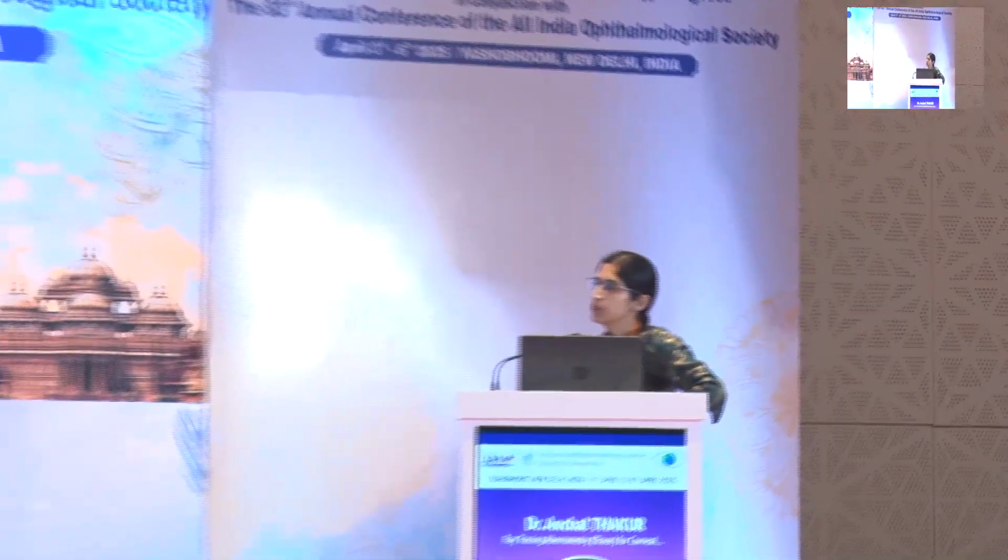This is a very good question. The subjective depth of focus is actually more than the objective depth of focus which the iTrace gives us. So even if we plan according to the iTrace, we'll end up landing a more continuous range of vision, because the subjective depth of focus will be much larger than what the iTrace is showing us. But definitely we can plan it, because objectification can be done using the iTrace.